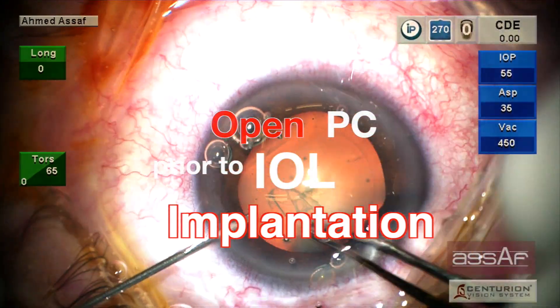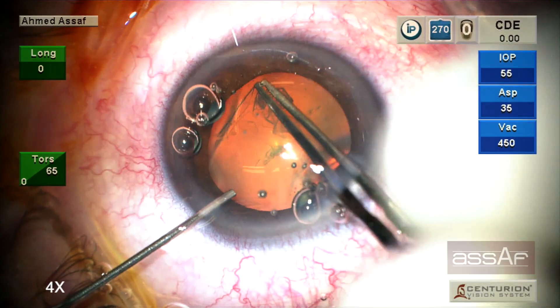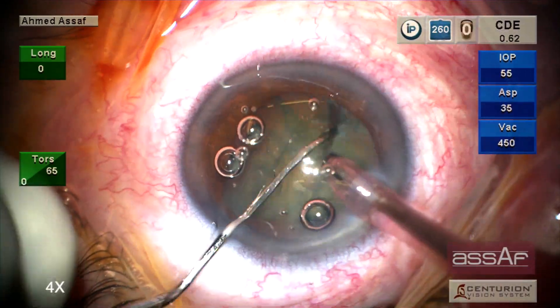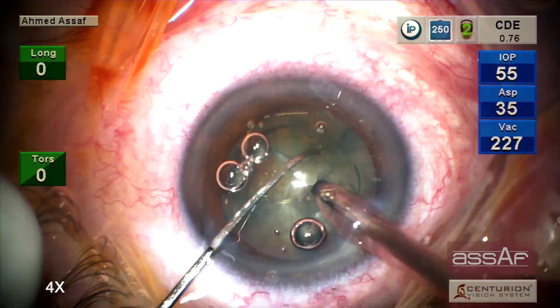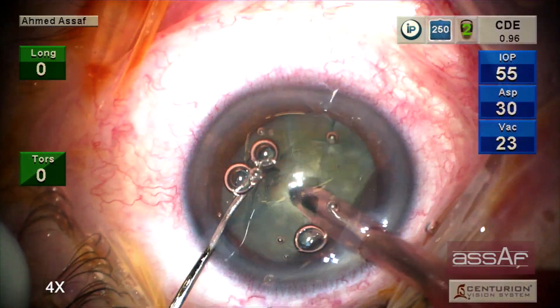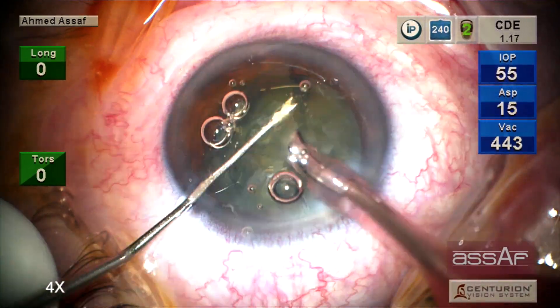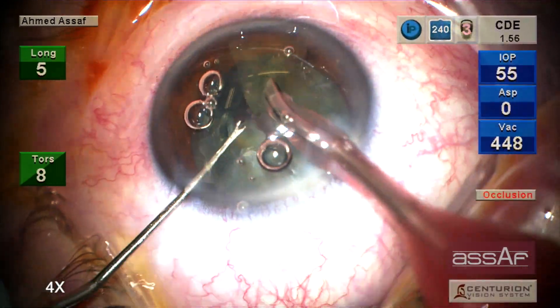This is a case of routine phacoemulsification of a nuclear grade-3 cataract, and this case was complicated by rupture of the posterior capsule just before IOL implantation. I have skipped and fast-forwarded the irrelevant parts of the surgery to focus on the incident itself.